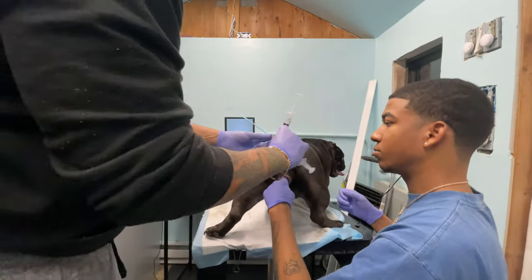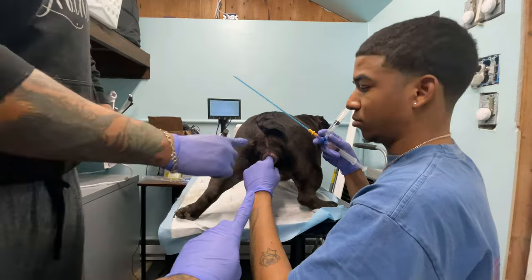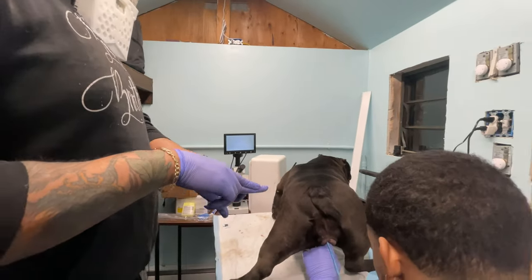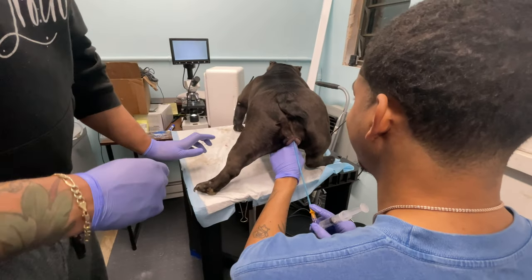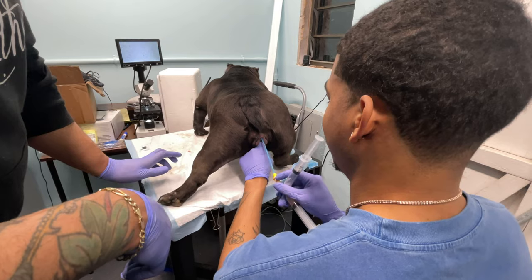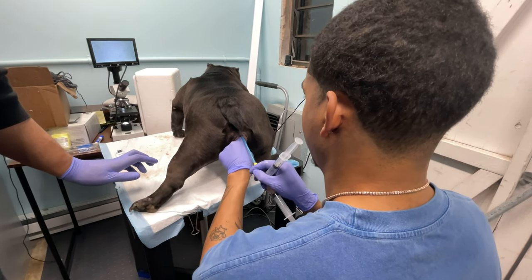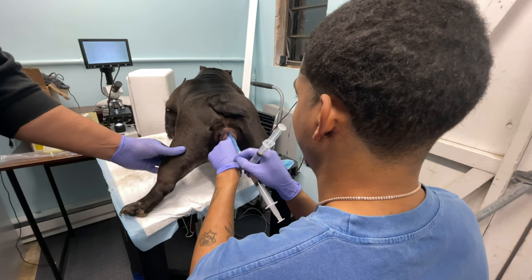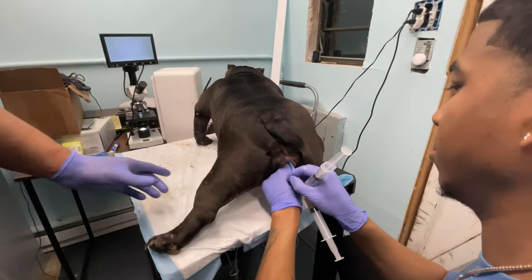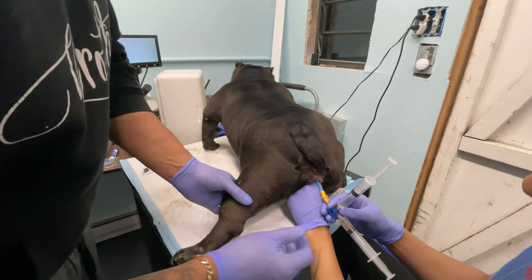The pipette is going to follow your finger — come in from the side of your finger and use the top of it, so it's going straight across your finger. Now bend it up past that corner. Sometimes you gotta wiggle your finger — not the pipette so much, but your finger — and it'll cause the pipette to go in more. There you go, perfect. When the breeding numbers are right you'll usually be able to get the whole pipette in, which is exactly where you want it — right at the end of that pipette.